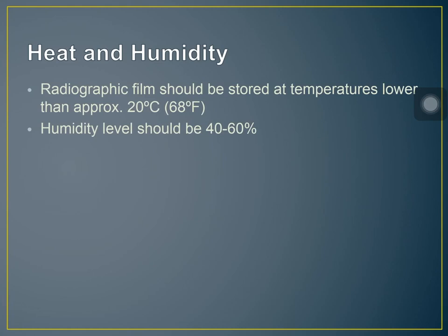So, back with the humidity level, if it dips down below 40%, there will be a static artifact. I'm not sure if it's crown or tree, but it's either of the two. Maalin doon sa dalawa. Yun yung nagkakos ng static artifact. Humidity level dips down below the 40%.